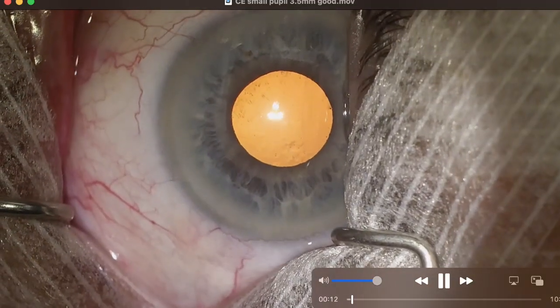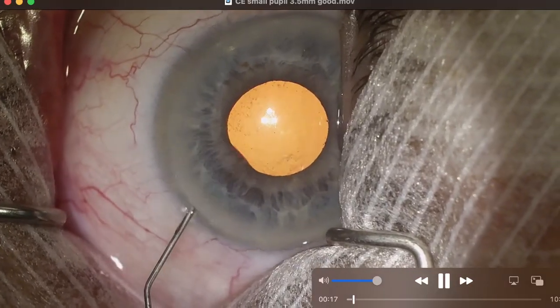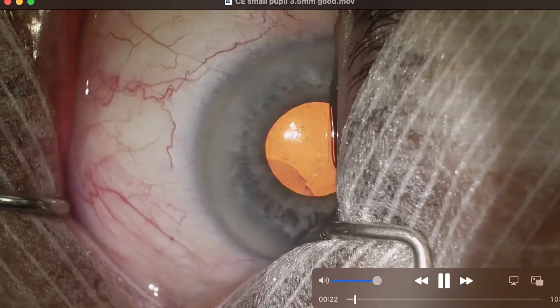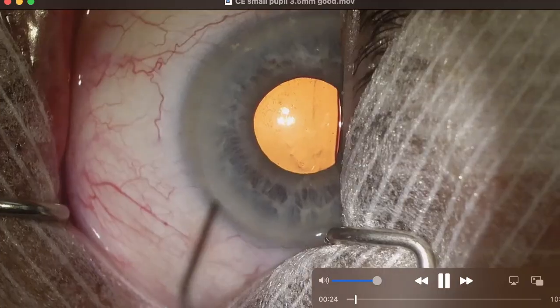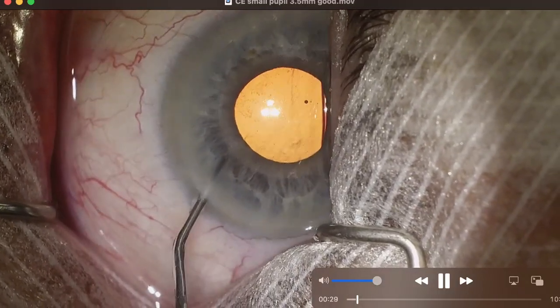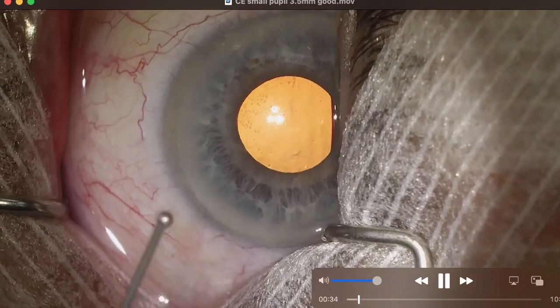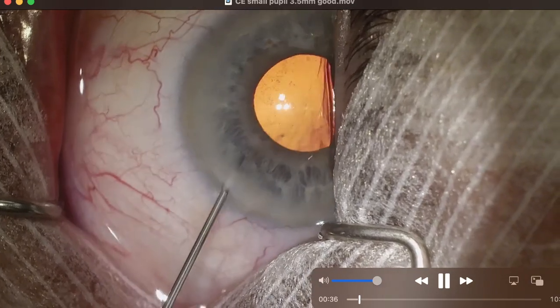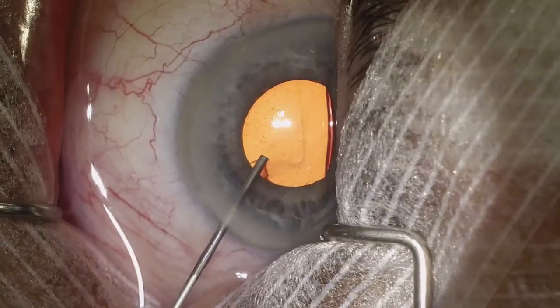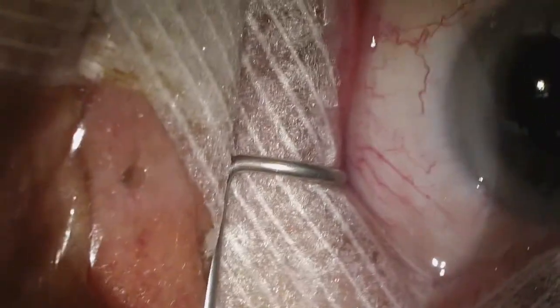You can see this pupil is somewhere between about three and a half to four millimeters in size. I started by making my paracentesis. I inject preservative-free lidocaine and then we're going to use epinephrine to stabilize the pupil so hopefully it doesn't get any smaller during the case, and then we use a dispersive viscoelastic — here we're using Viscoat.